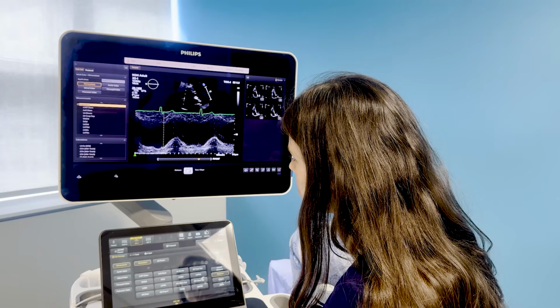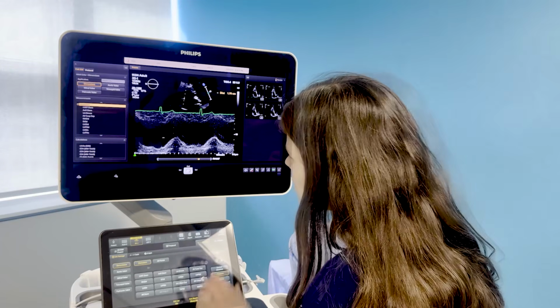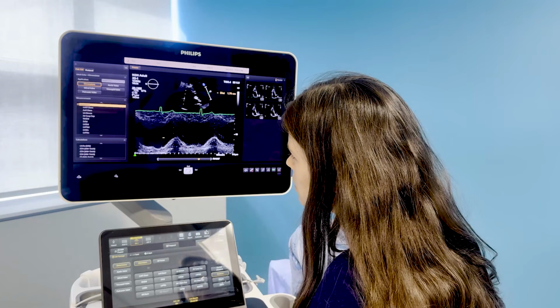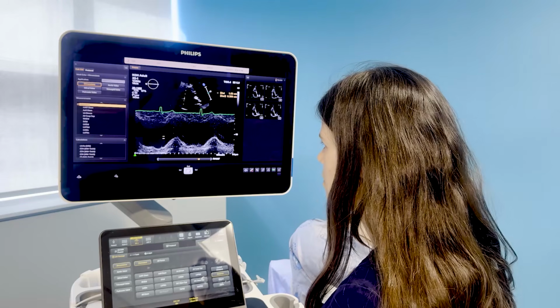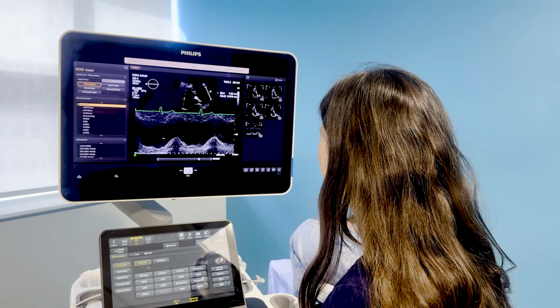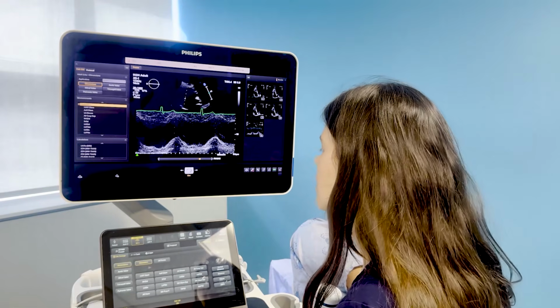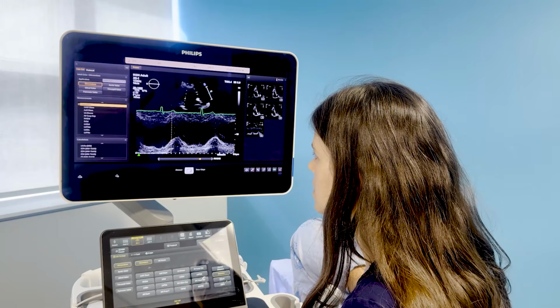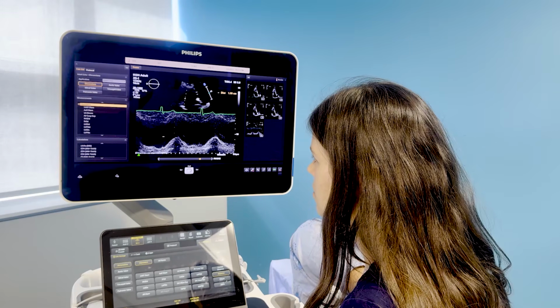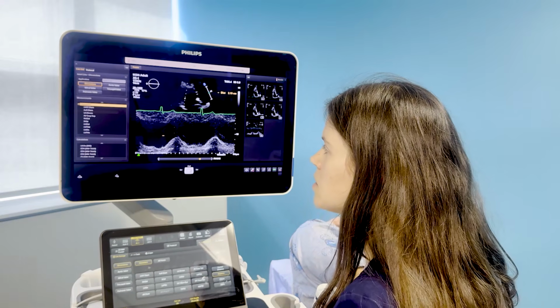Okay. So it's a measurement in the vertical plane. And ideally, I'm just lining up with this curve here. Okay. So down just a little bit. Now, I've seen people measure straight up, and they also measure at an angle as well. Yeah. I don't think it matters because it's going to take the vertical. This Philips machine only allows me to go up and down. Okay. So I'm not able to come over.